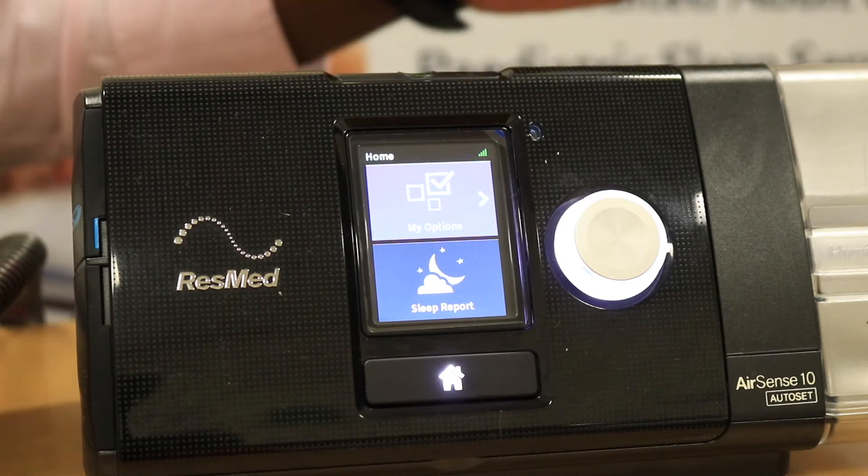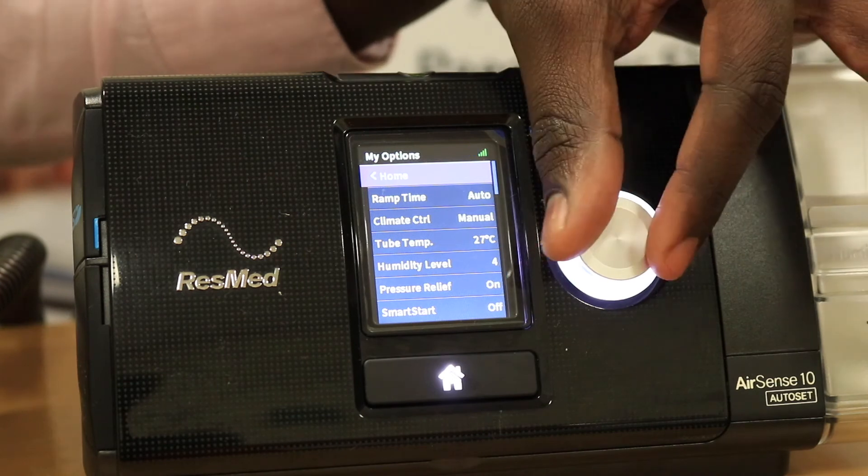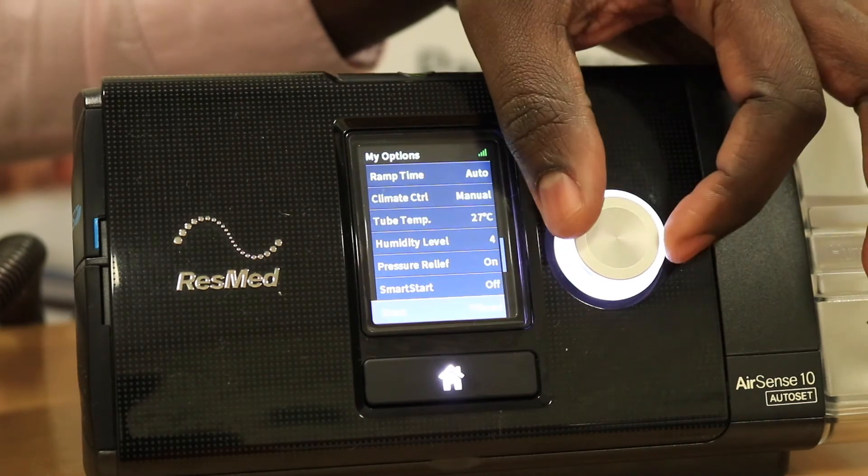All you need to do is highlight My Options and press the dial, then scroll down to Run Mask Fit.